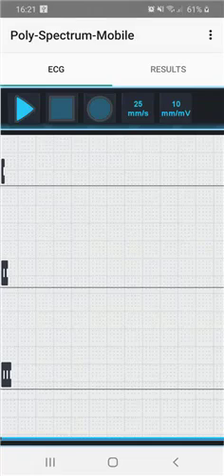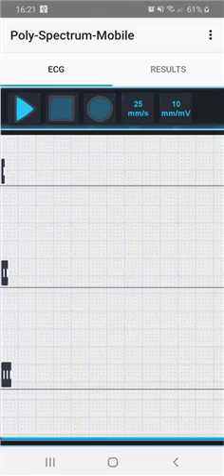PolySpectrum mobile software allows you to perform an ECG study in just a few minutes. I switch on the ECG recorder after setting up 10 electrodes on my chest beforehand.